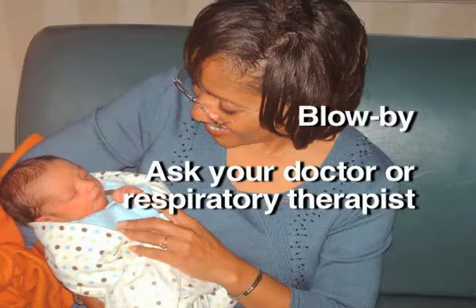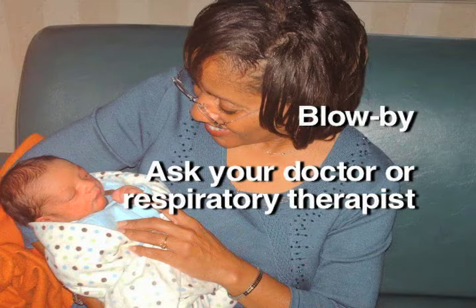Another but less effective way to give a nebulizer treatment is called the blow-by method. Delivery of medicines using blow-by should only be given for special situations. Your respiratory therapist or doctor will decide if this is a good way. Since the blow-by method is not preferred, we will not demonstrate this method.